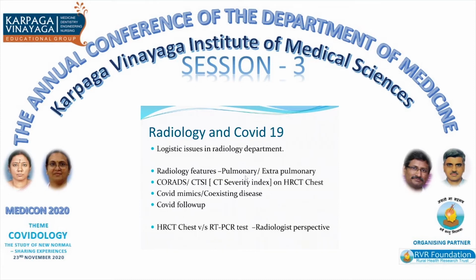Pulmonary forms about 90 to 95%, whereas extrapulmonary is around 5 to 10% only, but I'll be just telling what those are. And in the pulmonary, I would be speaking on the CO-RADS, then the CT severity index on the HRCT chest, how to look at it. And the most important topic is what are the COVID mimics and the coexisting disease. Because the COVID mimics are the other diseases which can mimic COVID, and that is responsible for overdiagnosing COVID.